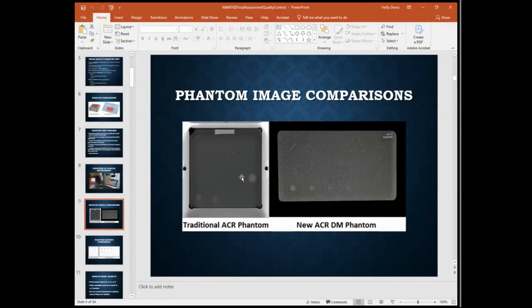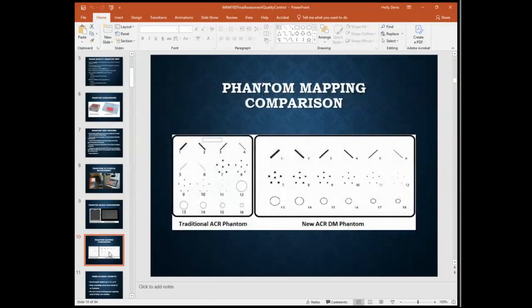It's probably been copied over a million times. And, plus I'm trying to show you on 2 different monitors. So that wouldn't pass if I could only see those 5 little specs. And we'll go into how many we should see and all that too. And then here's what your manufacturer's phantom will look like. Okay, so here's what we should be seeing. So keep in mind the slants of these fibers here.